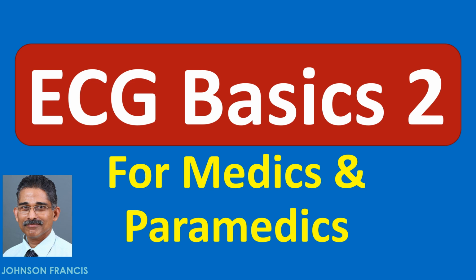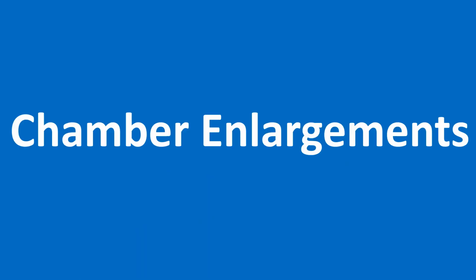Second lecture in the series on basics of electrocardiography. To start with, we have a discussion on ECG changes in cardiac chamber enlargements.